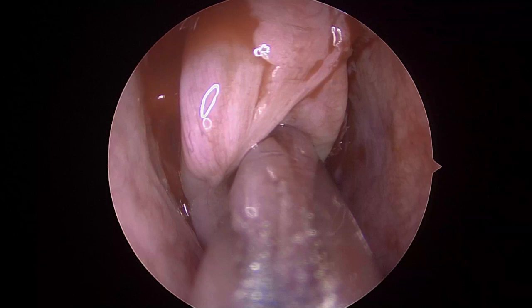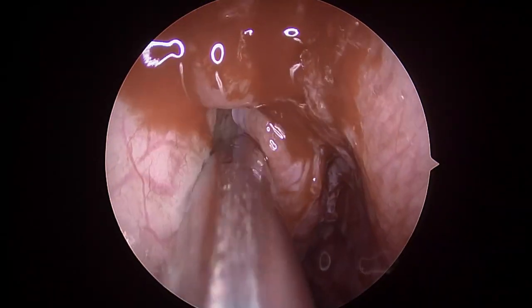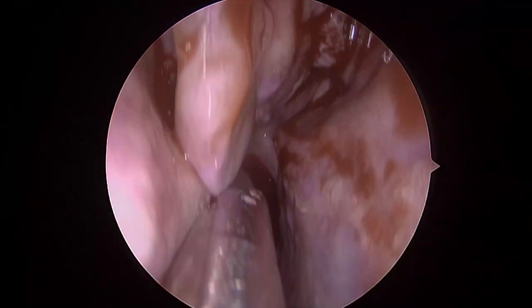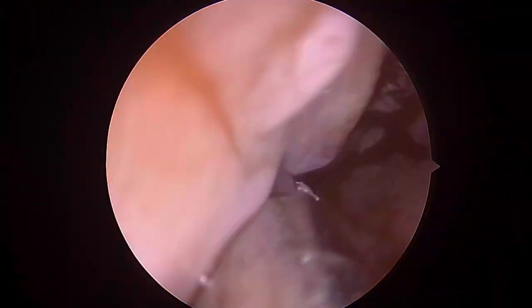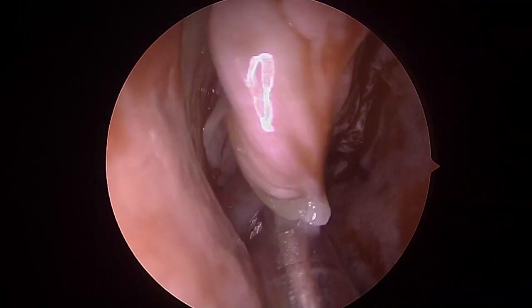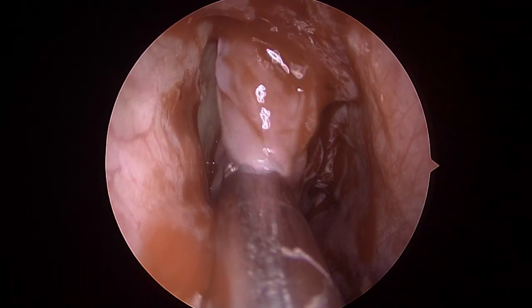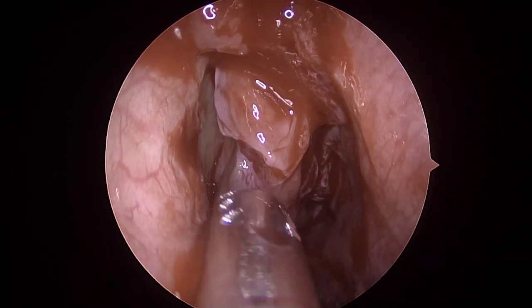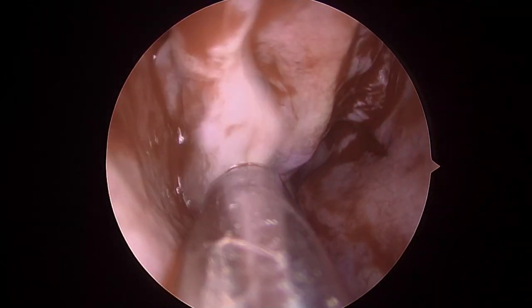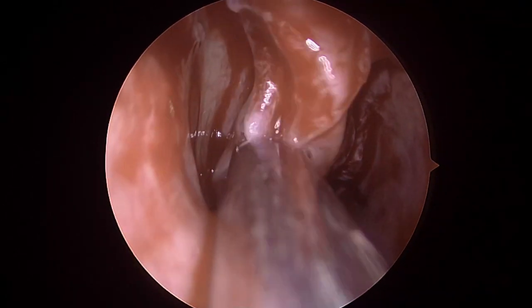Now I'm trying to locate the middle turbinate. So one of the tips that I was taught is always try and trace the middle turbinate from its posterior edge. And once you get that, everything anterior to it can go. So as you can see, this is the posterior end of the middle turbinate which attaches to the palatine bone.